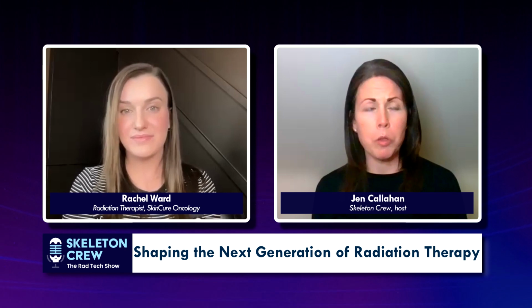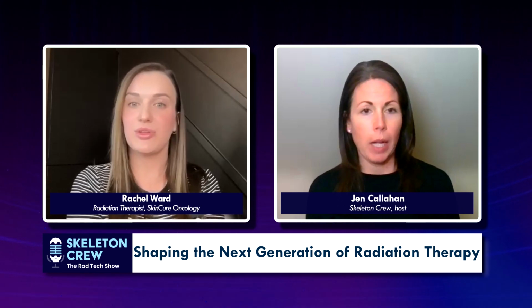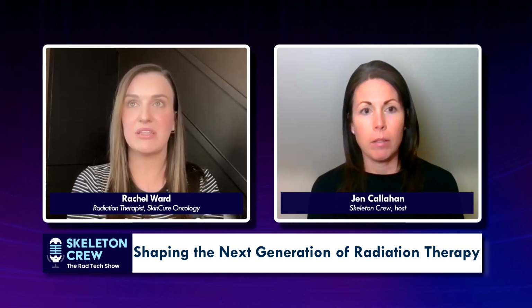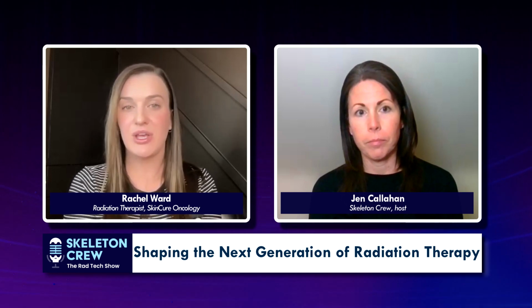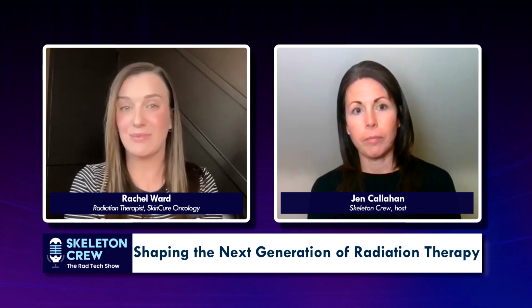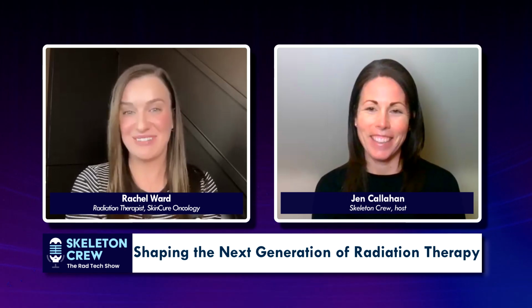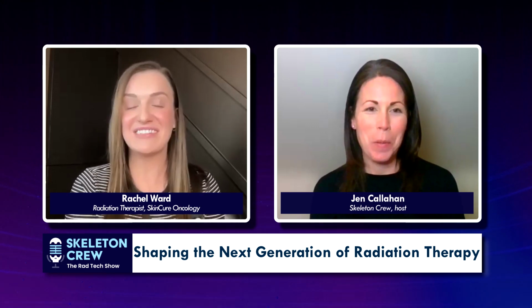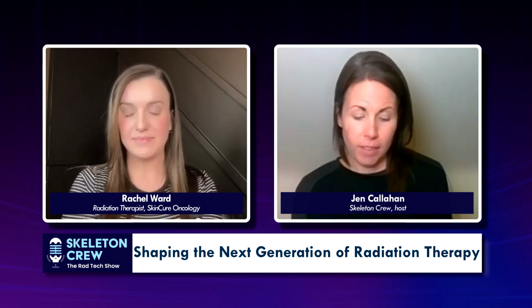To use this type of treatment that you were just describing, is it a certain stage that you'll go up to, like first and second stage cancer? If it's usually a certain depth, I believe the protocol says if it's deeper than 3.5 millimeters, and we can't debride it, and by we, I mean the dermatologist, I don't debride anything. If we can't have it debrided to have less thickness to it, then we are going to have them seek different treatment in a cancer center where they can use those higher beam energies.